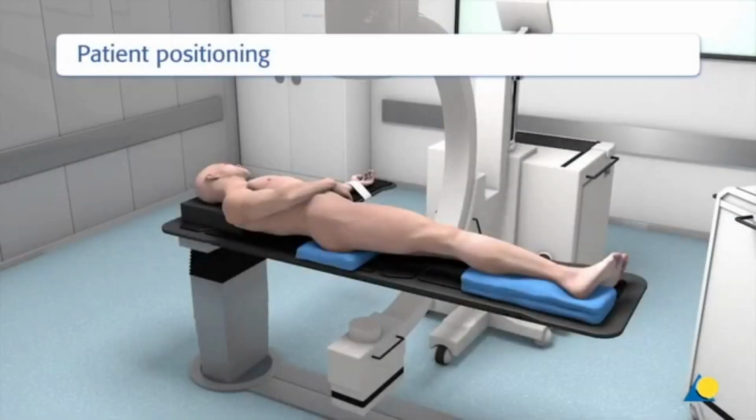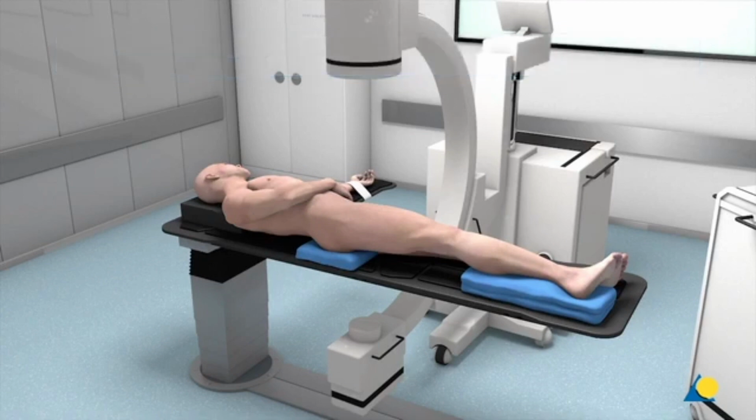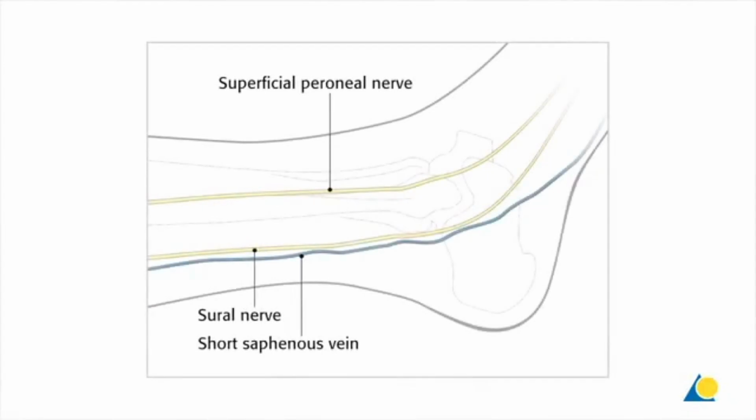The patient is positioned on a radiolucent operating table in a supine position with supports under the hip. A sandbag under the ipsilateral buttock rotates the limb and allows lateral and posterolateral access. The first step is the reduction and fixation of the fibula fracture. The standard approach is a longitudinal lateral incision.